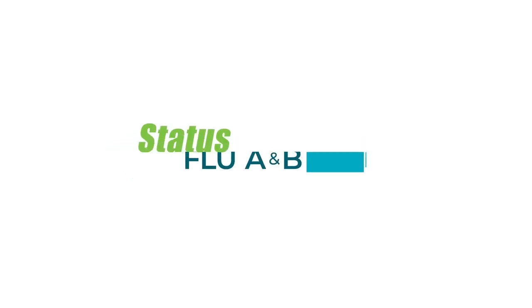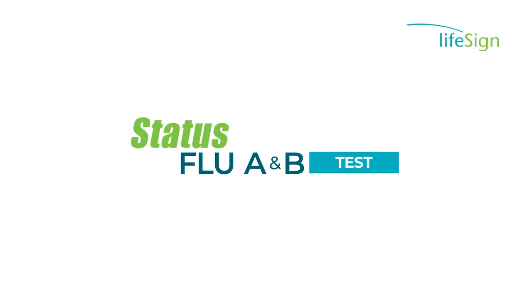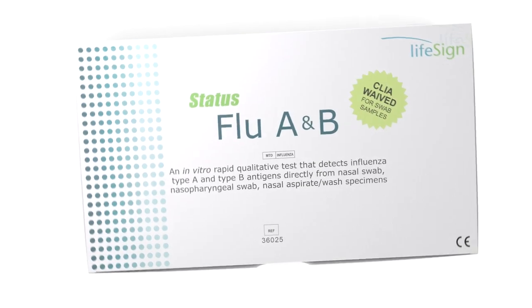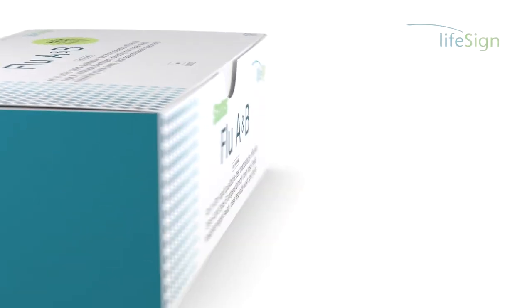The Status influenza A and B test is a CLIA Waived rapid qualitative test that detects type A and B antigens directly from nasal swab, nasopharyngeal swab, and nasal wash specimens obtained from patients with signs and symptoms of respiratory infection. This video demonstrates the nasal swab and nasopharyngeal specimen test procedure.